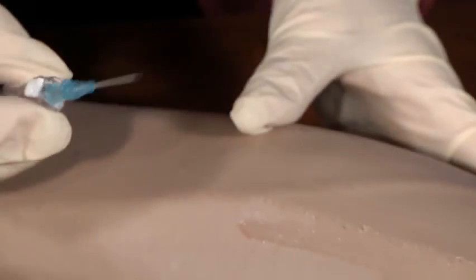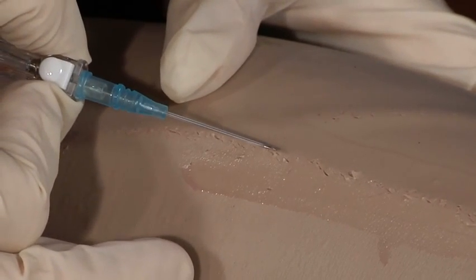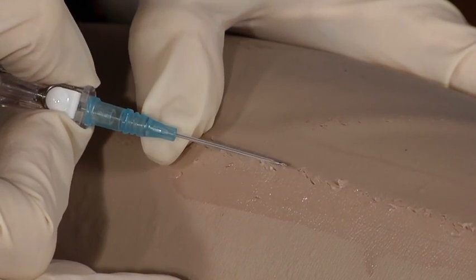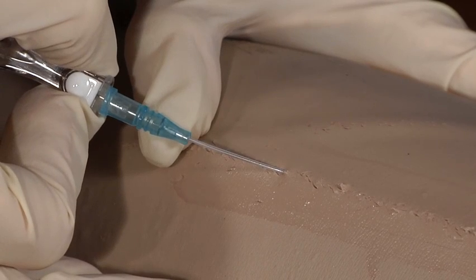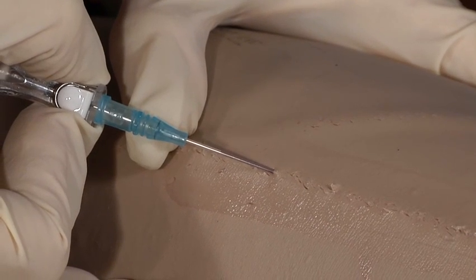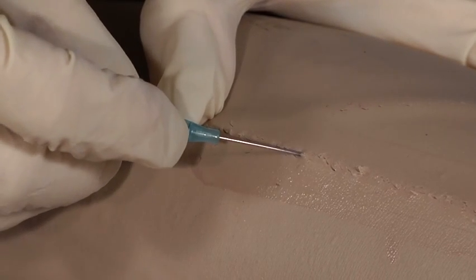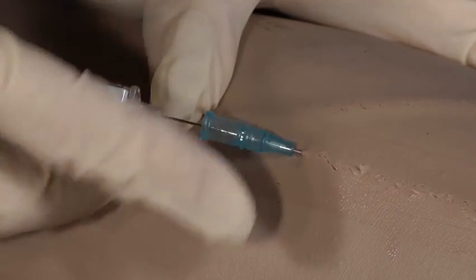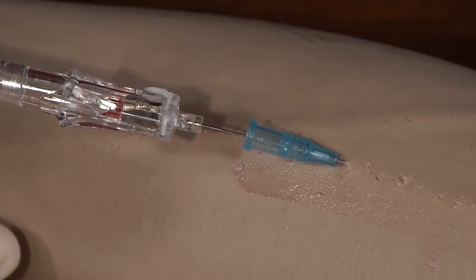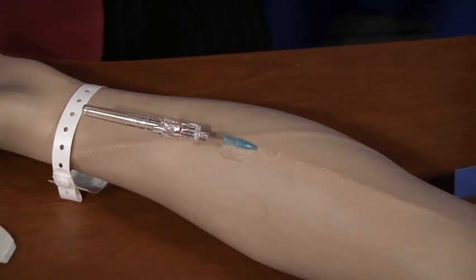Okay, so let's access our vein here. We'll come in at about a 30-degree angle. You want to put traction on that vein so it doesn't go anywhere, it doesn't roll on you. You can go over, you can go beside the vein. People do it differently. And as you can see here, I already have a flashback. The blood is coming into the catheter. So I want to advance it just a little bit more, about 1/4 of an inch. Then you'll advance the catheter, not the needle, just the catheter. After you've done that, you want to, what I call, pop your tourniquet. You want to take off your tourniquet. You want to get your solution.